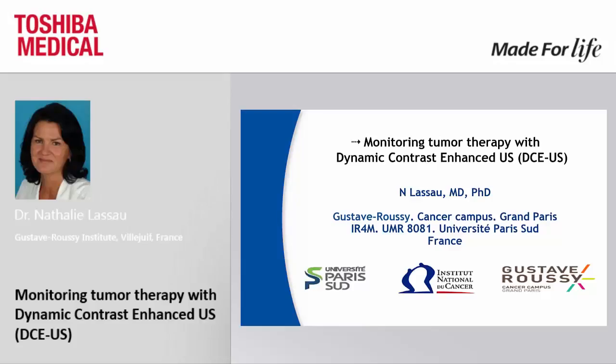Dear colleagues, dear friends, it's a pleasure to share with you my experience, and I would like to explain the interest of using contrast enhanced ultrasound for the evaluation of treatments.